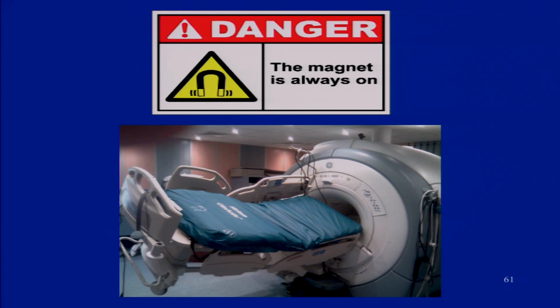So you need to always recognize two things. The magnet is always on. So at the end of the day, everybody's gone, the lights are turned out, the magnetic field is still there. The magnetic field is still on. It never is turned off. So whether a patient's in the room or the lights are turned out and it looks like everyone's gone for the day, you need to be aware of the strength of the magnetic field.